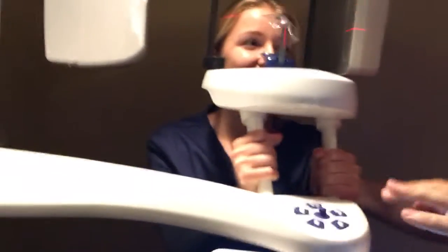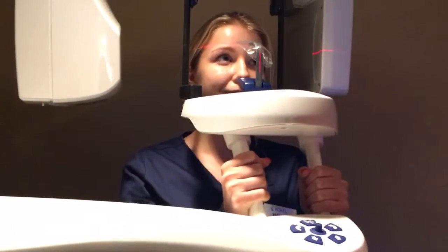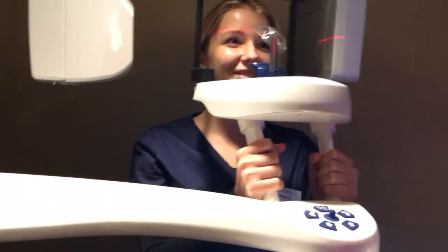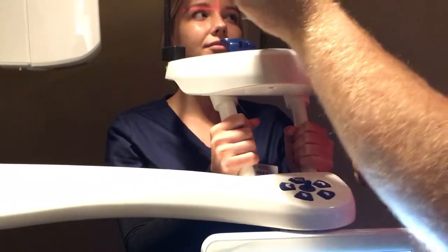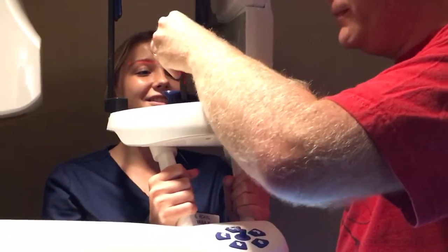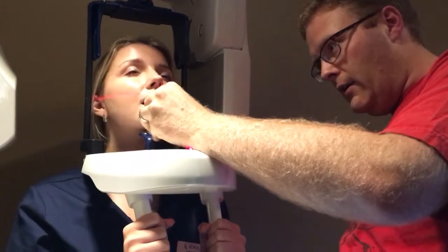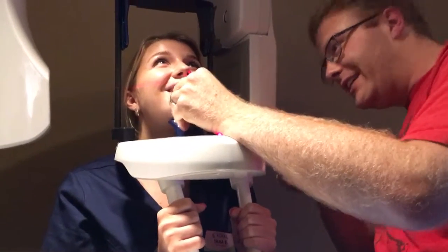I usually do a big explanation about foot positioning: I'll put my foot in front of your feet and you scoot forward until you kick me. Okay, I need your teeth in that groove — edge-to-edge, like you're growling. Nobody's been chewing on this bag so it's clean. I'll make it a little shorter. Go ahead and bite down on that stick — slide up, perfect, all the way back. She did it right.